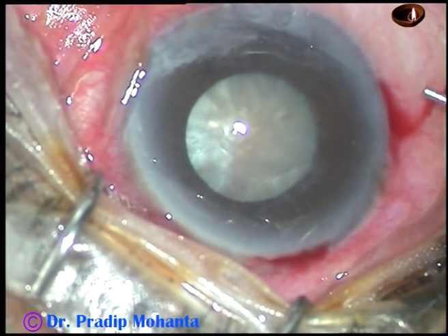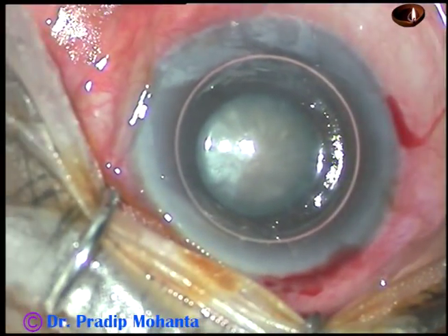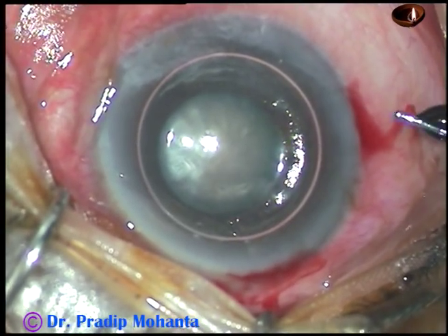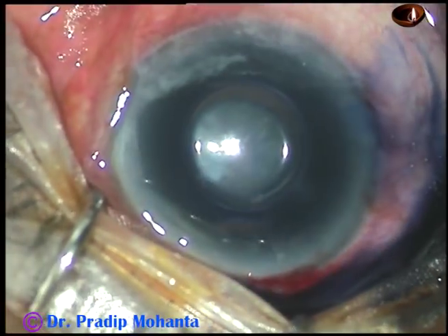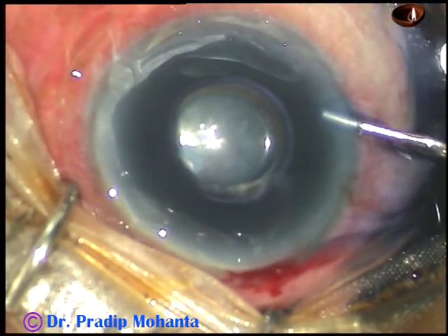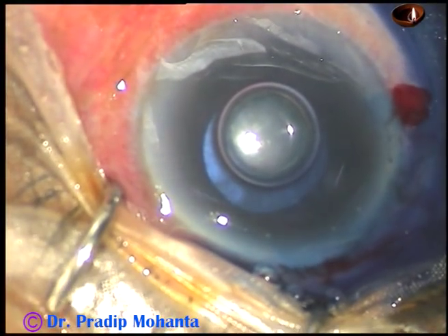Stain the anterior capsule with trypan blue dye underneath an air bubble. If you stain the anterior capsule underneath an air bubble, you will see that staining is immediate, and you will get very good staining within 7 or 8 seconds. Wash the dye out with BSS.